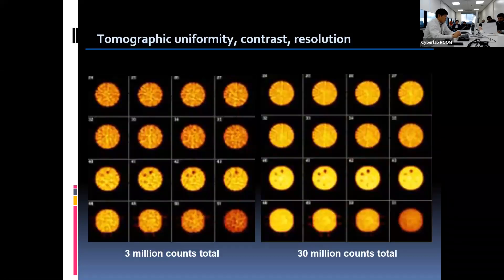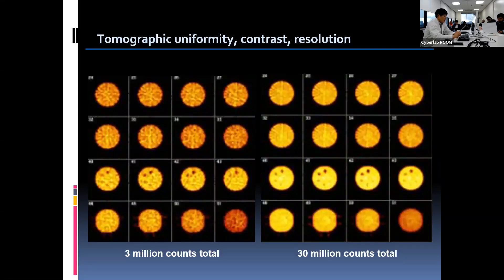If we acquire imaging with low counts, loss of spatial resolution can occur. The image on the left shows degradation of spatial resolution with low counts acquired. On the other hand, the right image acquired with 30 million counts has quite good resolution.